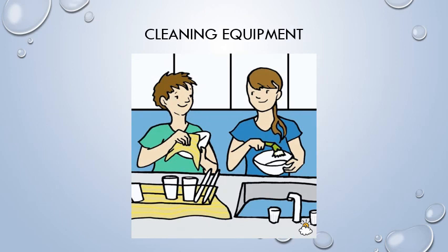All equipment for completing a tube feeding is washed in the kitchen sink with clean, soapy water. The equipment must be rinsed well to prevent tubes from blocking. All equipment is set in a dish drainer only for that equipment or on a paper towel to air dry. There will be a nail in the kitchen cupboard to hang bags to dry. All equipment is washed after each use.